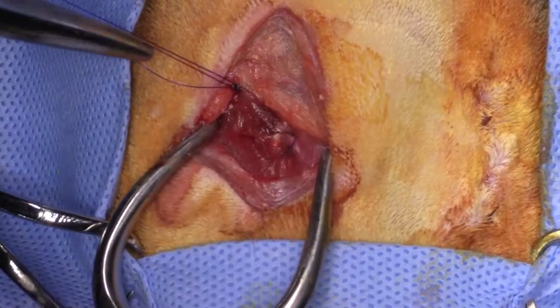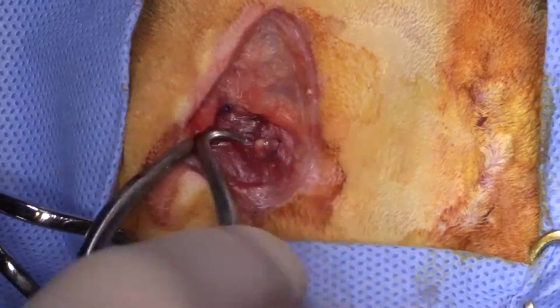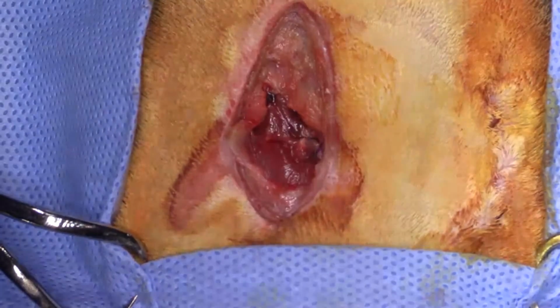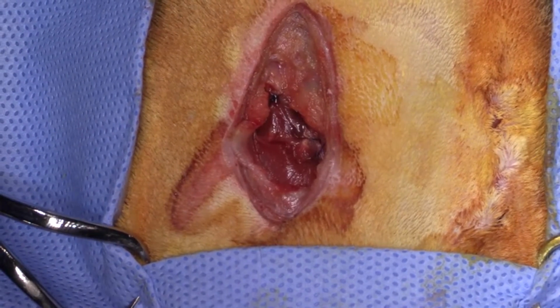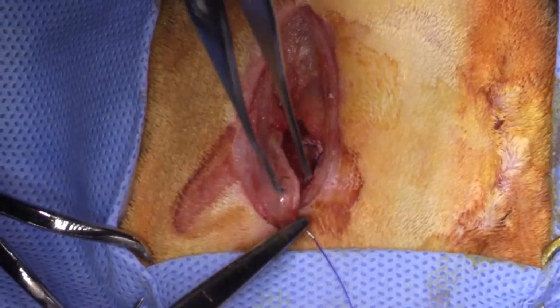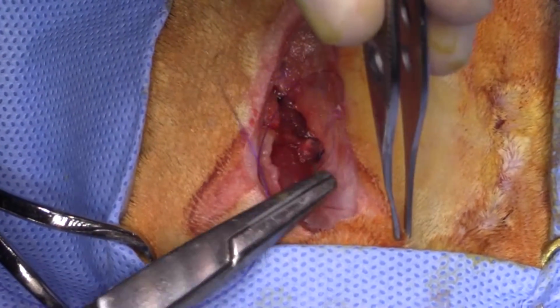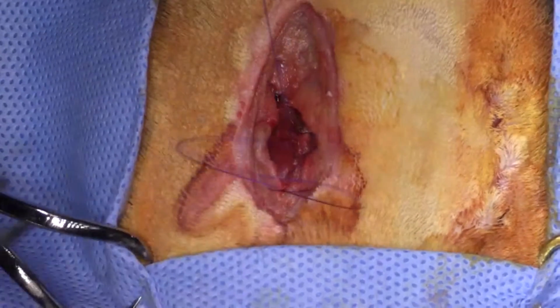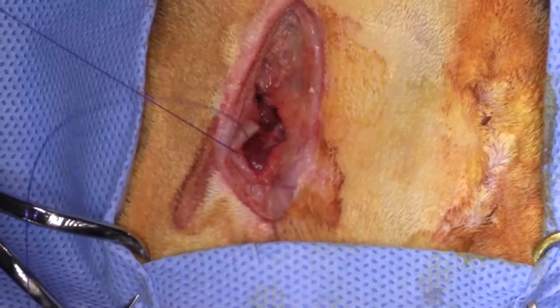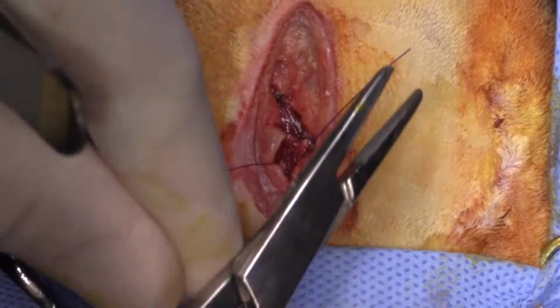Rechecks, 1 week and 2 weeks, please. Don't forget to get the oral polyp, yeah. We'll have to open up the mouth, Janine, and have a look down there and pull that out. Do you want the mouth gag? Sure. And then a spay hook, please. So I'm going to use a mouth gag and a spay hook in order to get a better look down there in the oral cavity, to pull the soft palate forward. That's how we'll have a look.